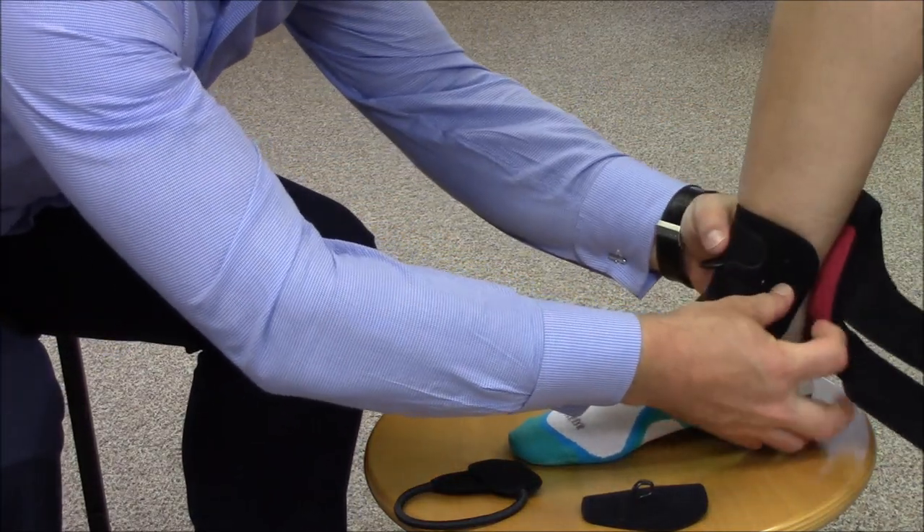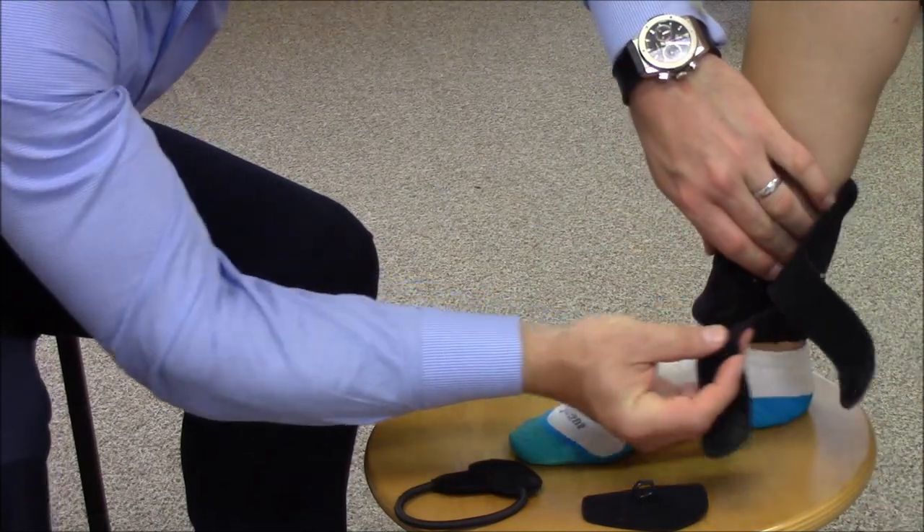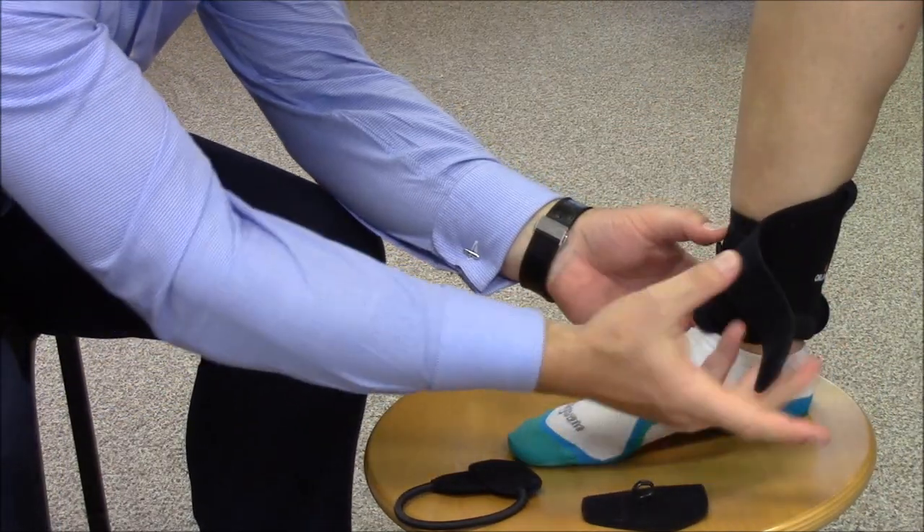Loop the two hook fastening systems around the anterior of the ankle ensuring the D-loop is exposed.